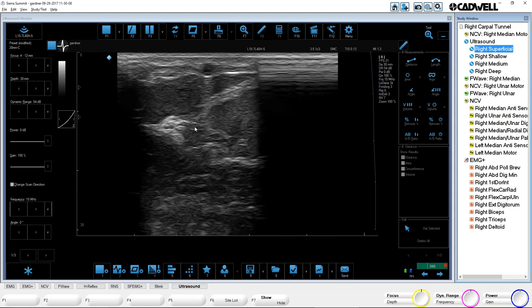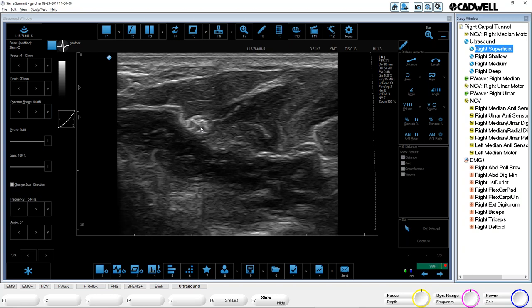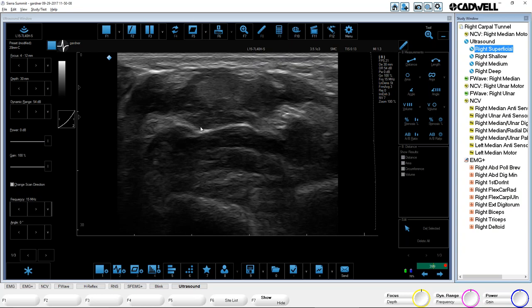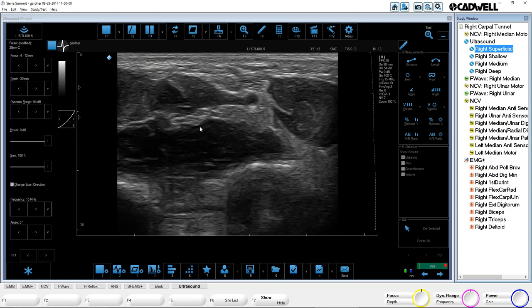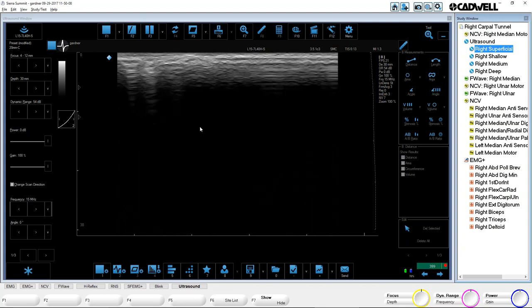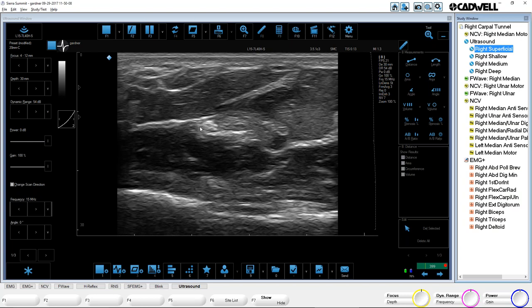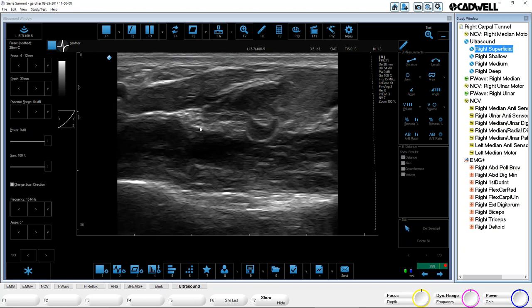I'm putting my mouse here so you can see the cursor. If you look at that round structure — my median nerve — it's right where the mouse is. We're doing a cross-section view. The way you know it's a median nerve is if you can follow it up and down the arm. You can kind of tell a nerve because you can follow it — see that round structure right where the mouse is? That's the median nerve. As I go up more towards the wrist, you can see it getting more shallow and closer to the skin, and as I come down, it gets deeper into my forearm.